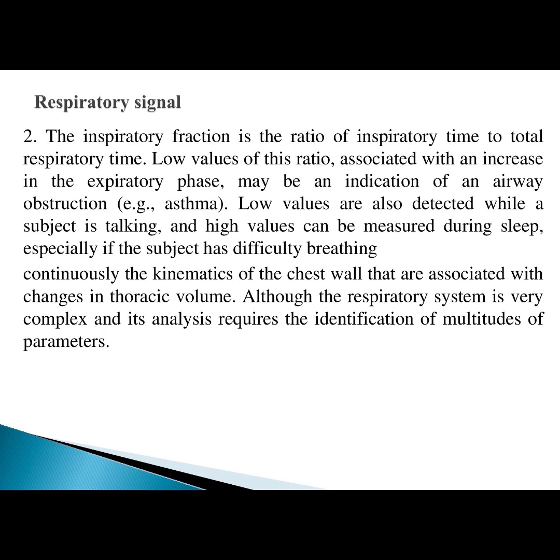Low values are also detected while a subject is talking, and high values can be measured during sleep, especially if the subject has difficulty in breathing. Continuously, the kinematics of the chest wall are associated with changes in thoracic volume.